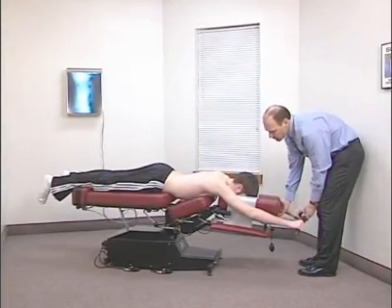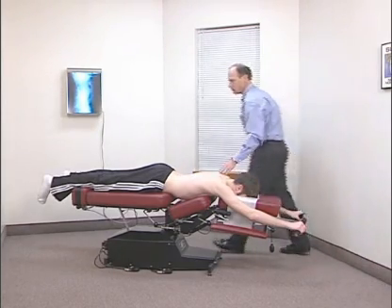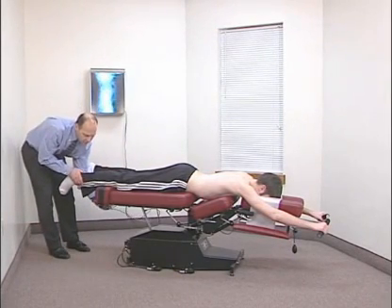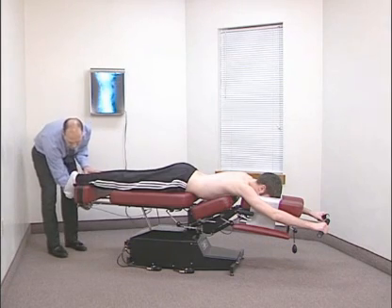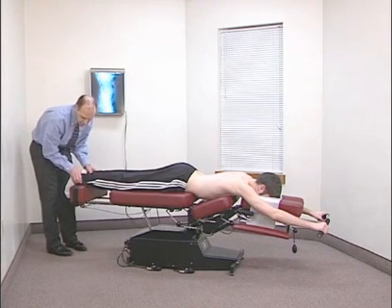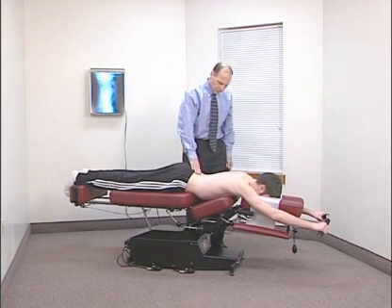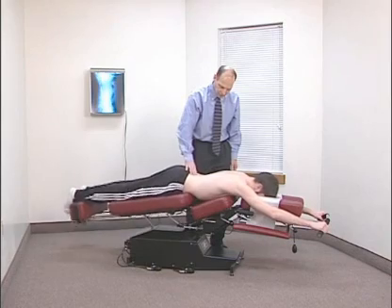Slowly lower the hinged cervical section approximately 25% from the neutral position to the floor. Pull back on the foot cushion to the top edge of the foot. After the patient has been properly positioned on the table, inform the patient that you are going to start the table in motion, causing the bottom section of the table to move. They may feel a stretching or pulling in the low back.